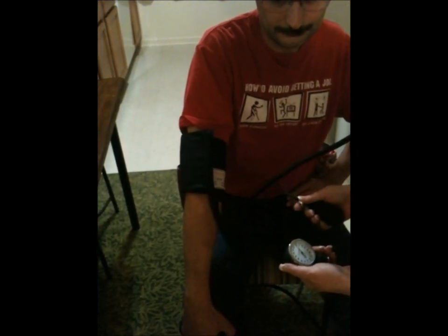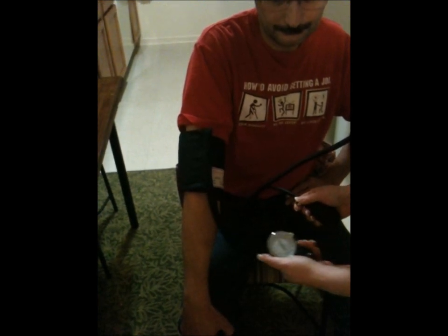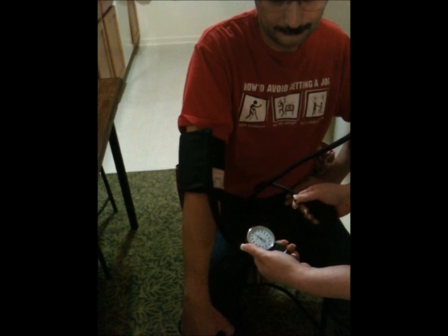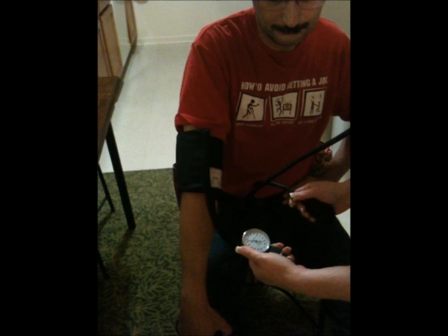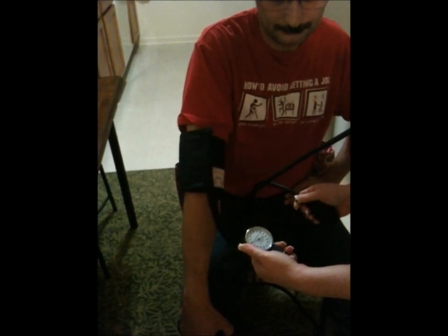Once you reach 200, slowly deflate the cuff until you hear the first heartbeat. The first heartbeat you hear and the number you see will be the systolic pressure.